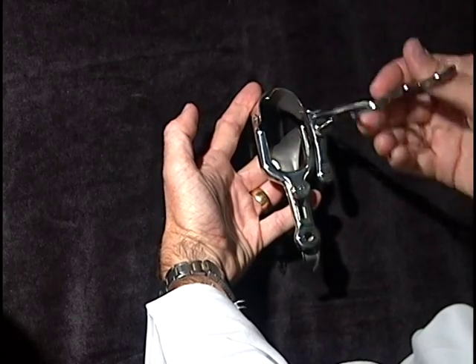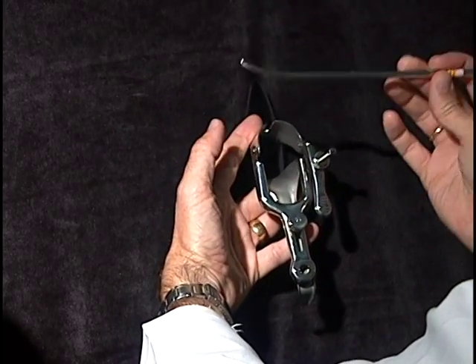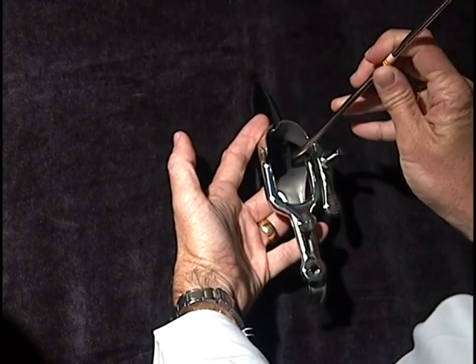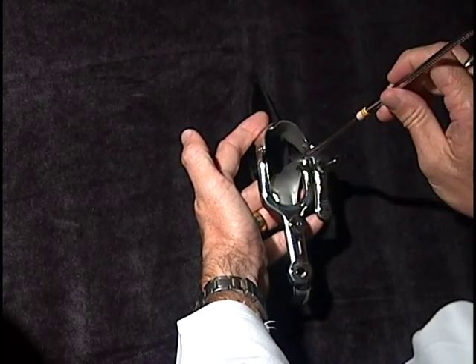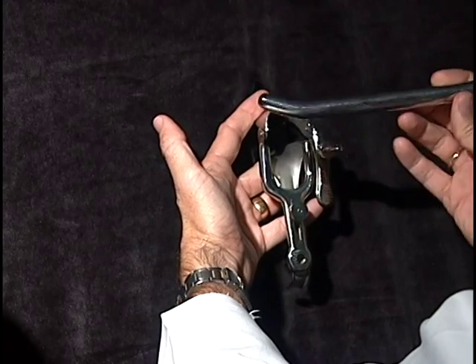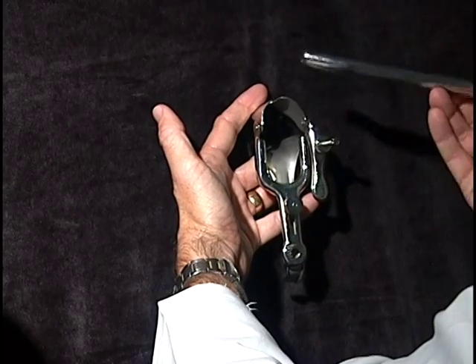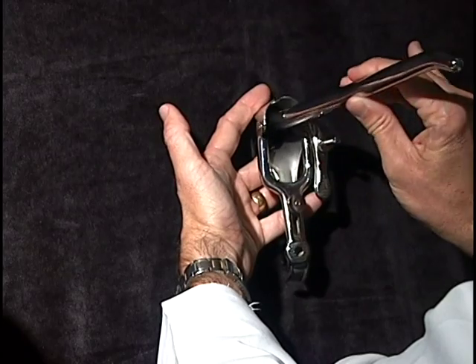Once the abortionist has control of the cervix, he has to start to open it — a process called dilating. This is called a dilator. There's a whole series of about ten or twelve of these, starting off small, which are then passed through the opening of the cervix. Each is flipped to the larger size, progressively opening the cervix, up to a larger dilator. How far along the pregnancy is determines how large the cervix needs to be opened in order to remove the baby.